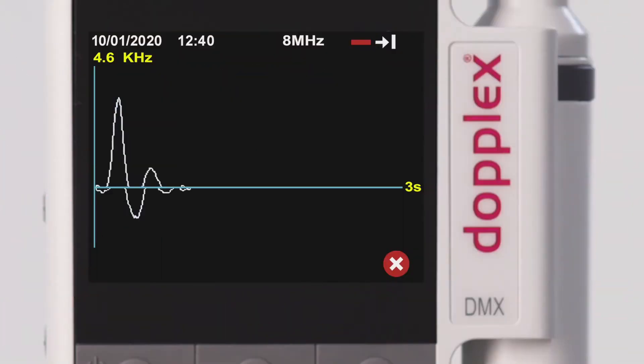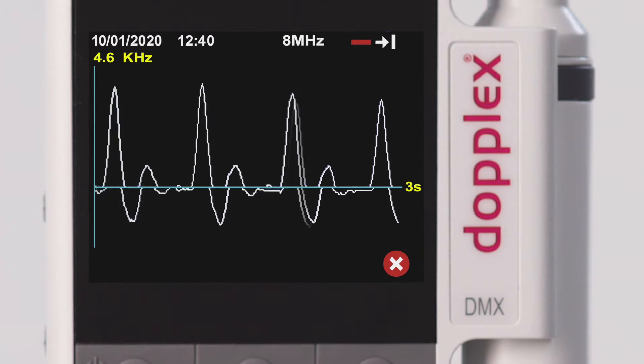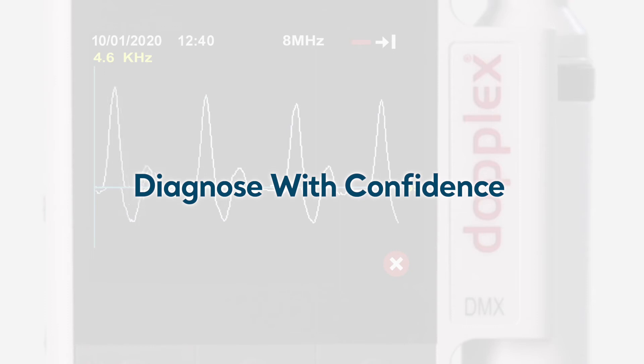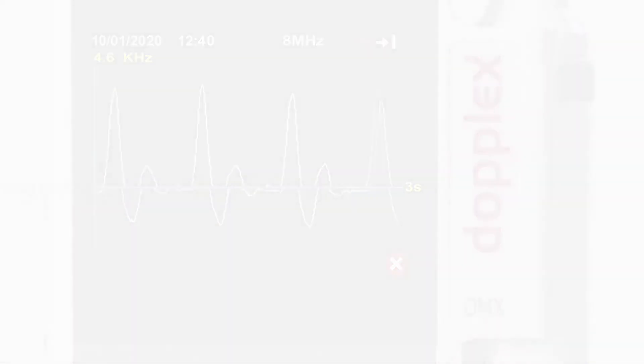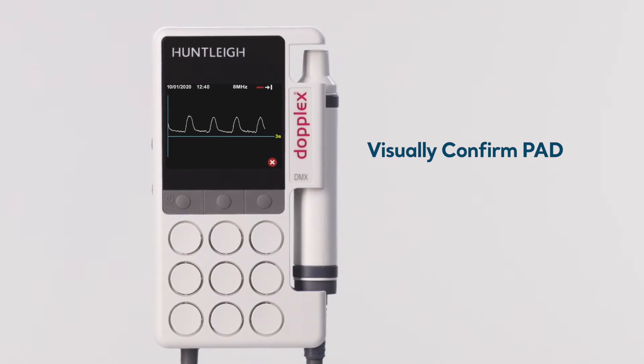The high-resolution color waveform display instantly shows waveforms for easy and clear assessment. This provides the ability to diagnose with confidence, not just relying on sounds. With the waveform display, you can confirm PAD, peripheral arterial disease, and other conditions.